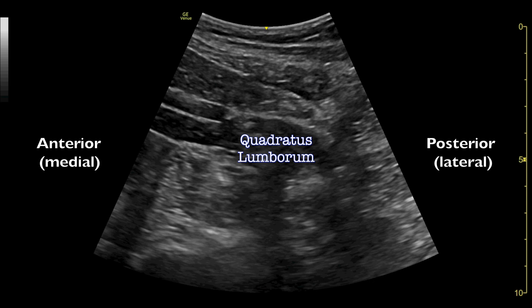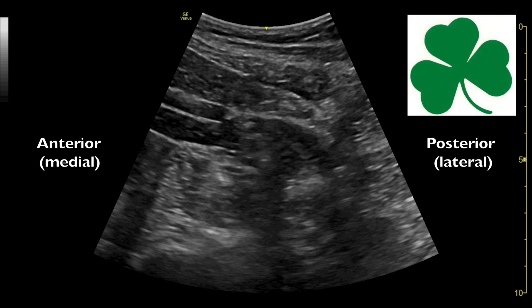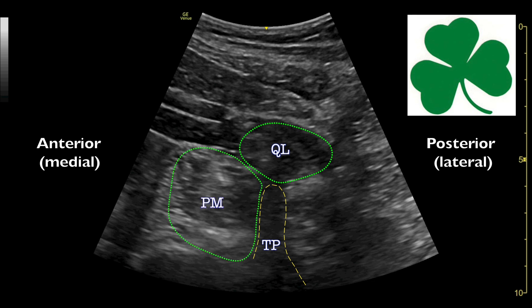Now take a look at the big picture to visualize the shamrock sign. Look for the transverse process — at this level, it is usually the transverse process of L2 or L3 vertebra. The transverse process will be the stem of the shamrock, pointing towards the quadratus lumborum muscle as one of the leaves. The other two leaves of the shamrock are the psoas muscle anteriorly and the erector spinae muscle posteriorly.